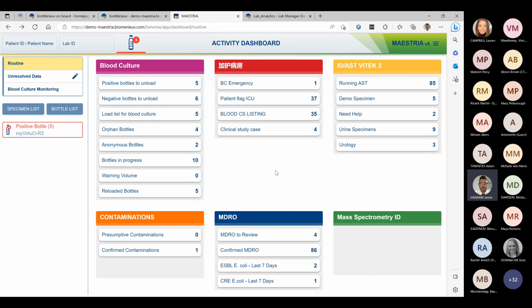It's not around what some R&D guy at bioMérieux decided you might need 3 years ago when development started. It's about what you need now, and more particularly what you might need tomorrow. I'll just show you what we can do further to that in support of some of the blood culture modeling that Kate outlined for us.